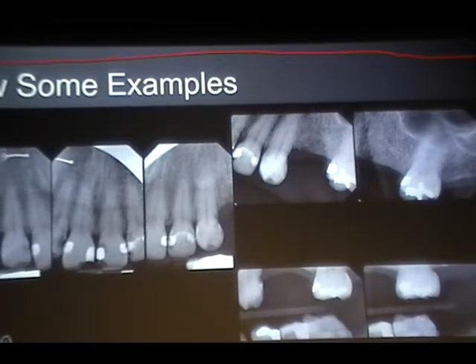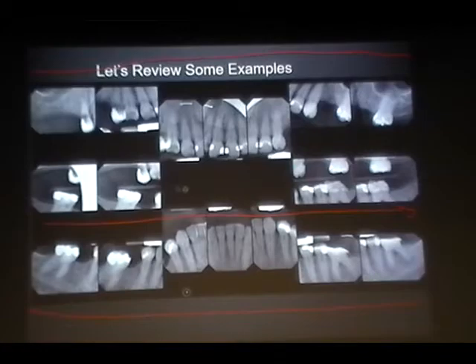Okay. On that one, by the way, is it appropriate, I don't know how the sensors work with this, to have the patient actually go and hold the sensor in place while you're taking that? Because I know with some of the thicker phosphorus plates, you can have the patient actually hold it in place while you're taking the X-ray.